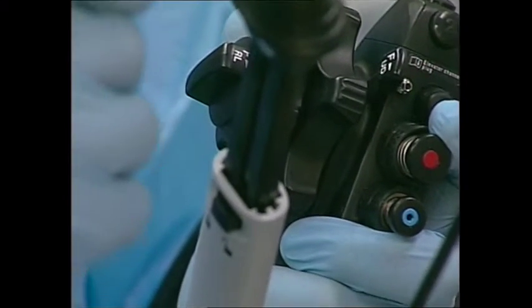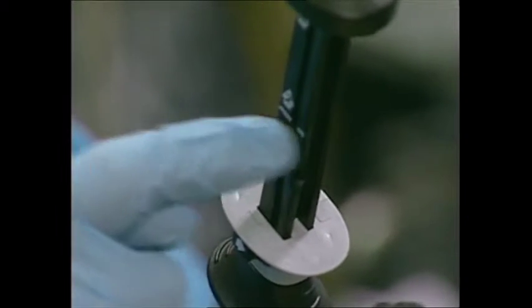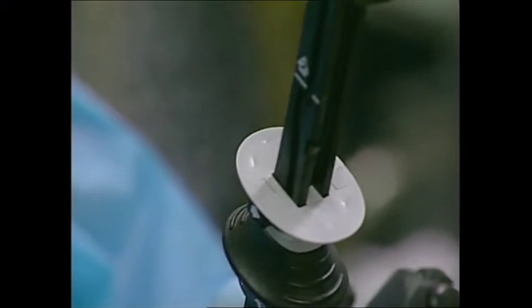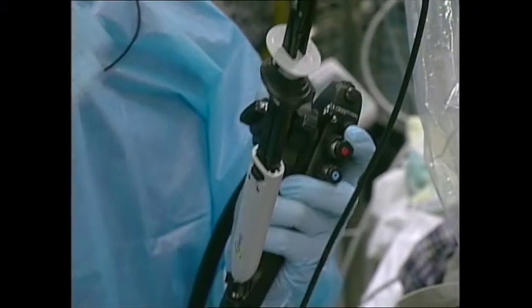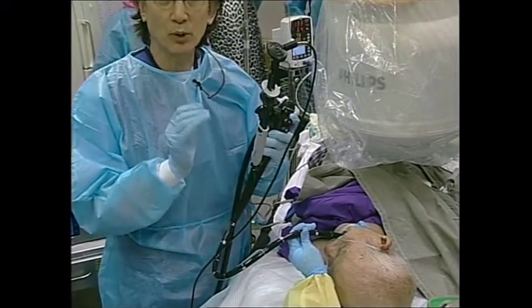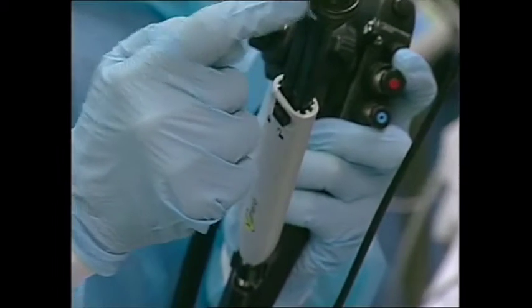And then there's hub number 2, and by pulling this hub upwards, we will first deliver the distal flange, and that will lock at this point, and then we're going to deliver the proximal flange. The release of each of those flanges is completely independent of one another, and that's really key, that the endosonographer can control the release of the flanges him or herself. There are locks here. These are safety locks, so I'm going to start by now unlocking hub number 1.